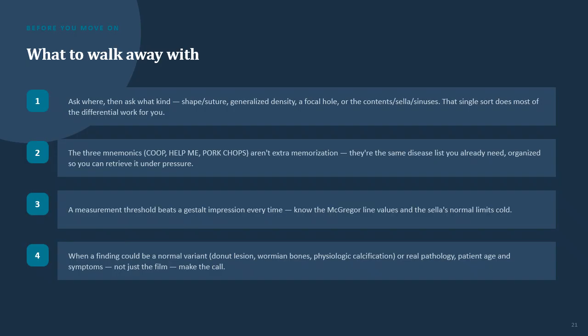So again, we try to identify the pattern first, although we're not memorizing any of these things, and look at where the location of the pattern is. Typically, we're not making measurements, but the doctor or radiologist will make measurements, looking at their age and also some of the symptoms or their clinical history to narrow down what the cause is.